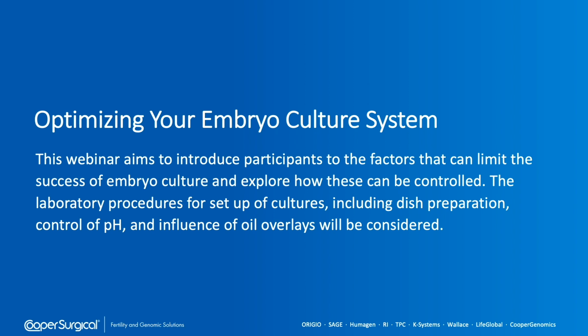In present circumstances, we put a lot of pressure on our culture system to perform, with us mainly going to day 5, day 6 or even day 7 culture to give us blastocysts that will give better choice of embryos for embryo transfer, reduce multiple pregnancies and allow material for genetic testing. Hopefully then this leads to giving our patients the best possible chance of success and delivering a healthy, normal baby.